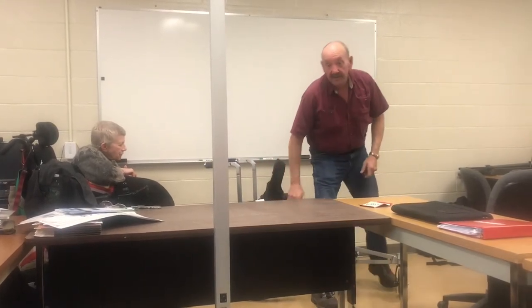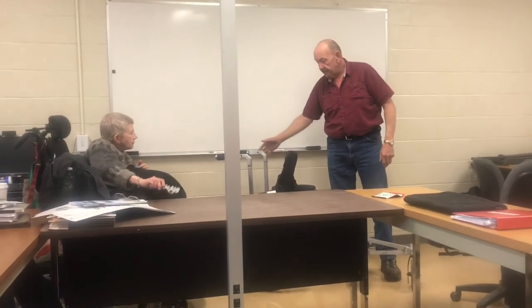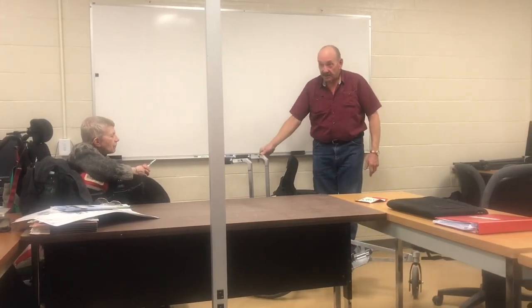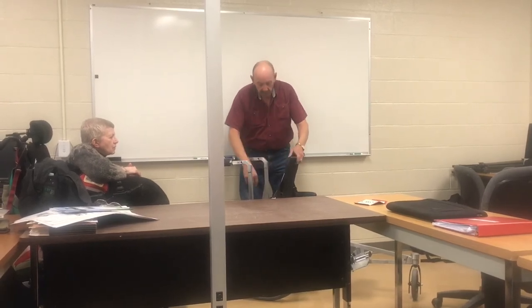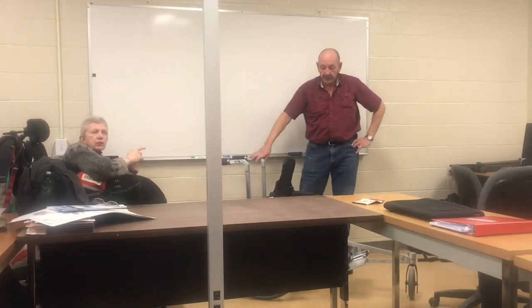If you put a hundred pounds on there versus two hundred pounds, there's a lot of variability and adjustability on this. As you can see, it goes together pretty easy and comes apart the same way. It stacks up kind of nice and deep, so I think this is going to be a win-win situation all the way around. Before we do a disassembly video, any questions?